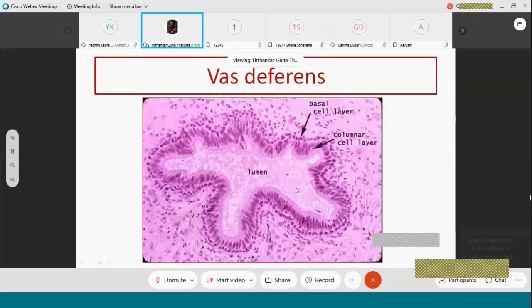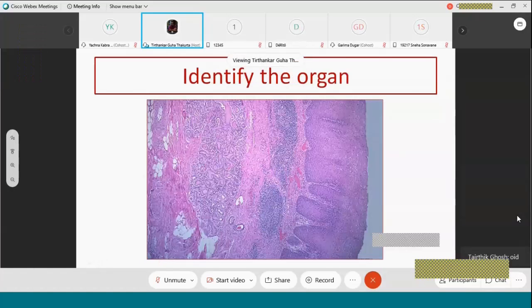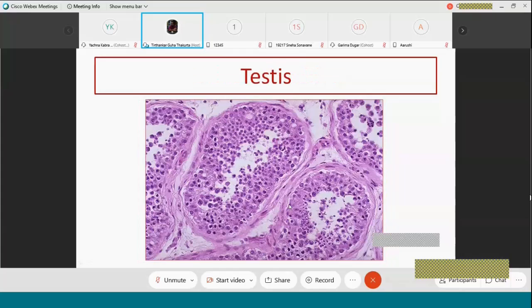You have already seen transitional epithelium. So transitional epithelium has multiple layers of cells in it, and they have a stretchability that makes them transitional. So some cells are elongated, some are vertical, so they have the ability to bear stretch. So this is the urinary epithelium. If you look into this epithelium and immediately then look into this epithelium, this is definitely not the same epithelium.